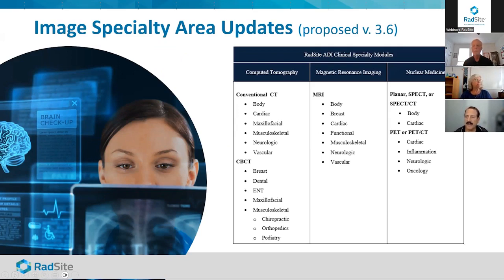It's relatively standard to make measurements with certain phantoms for conventional CT, but there's much less agreement with cone beam CT. In fact, much of what's done in cone beam CT by the physicists is actually utilizing the vendor's own phantoms and the vendor's own standards.